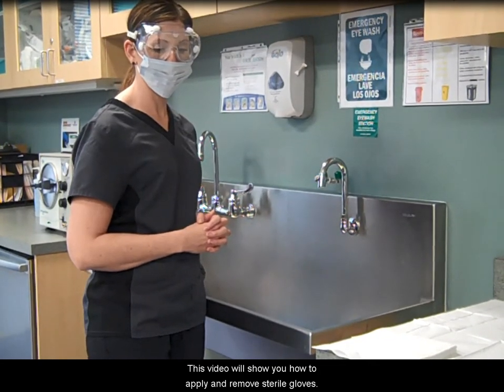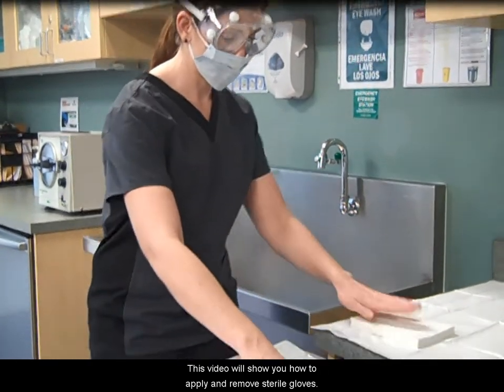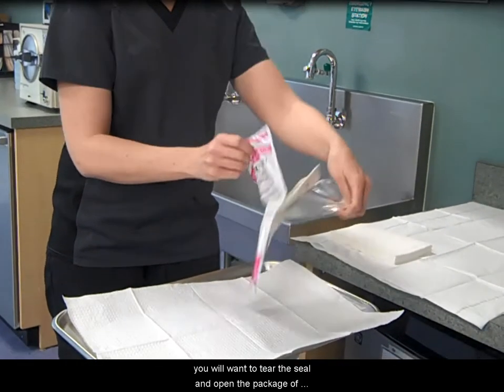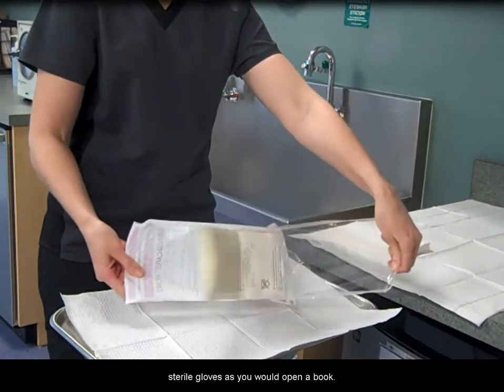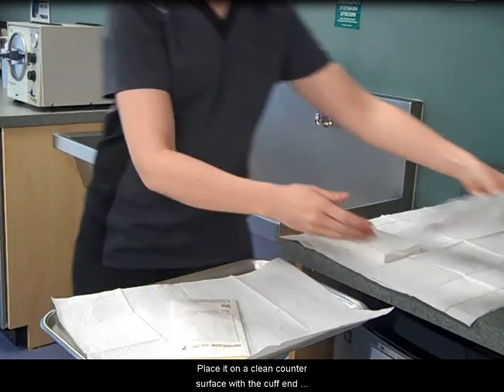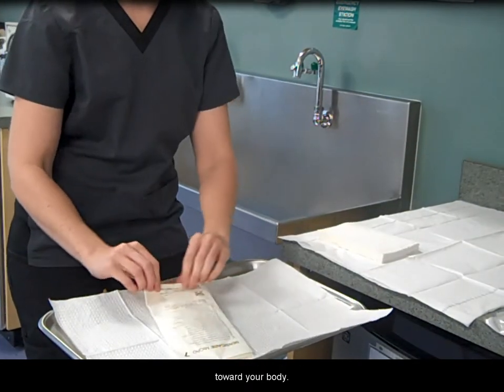This video will show you how to apply and remove sterile gloves. Before surgical asepsis is complete, you will want to tear the seal and open the package of sterile gloves as you would open a book. Place it on a clean counter surface with the cuff end toward your body.